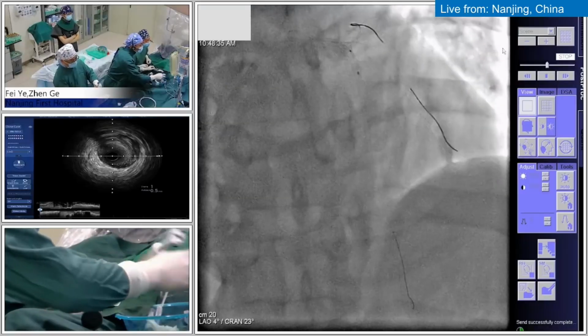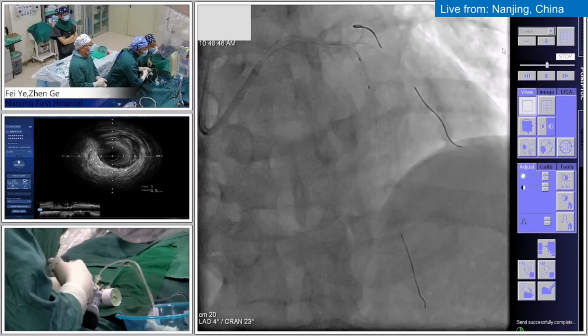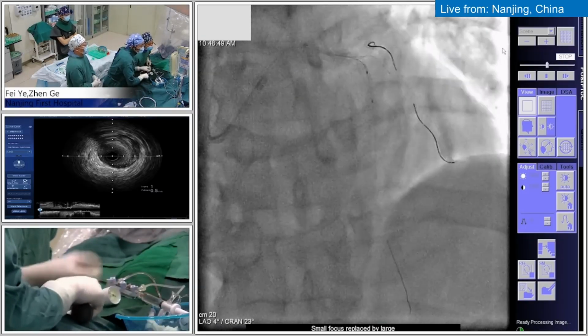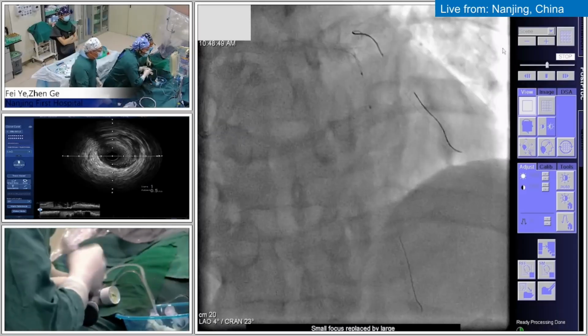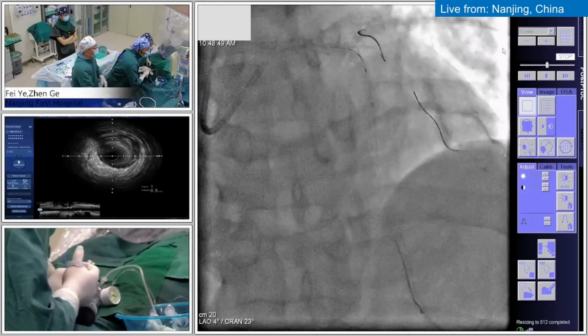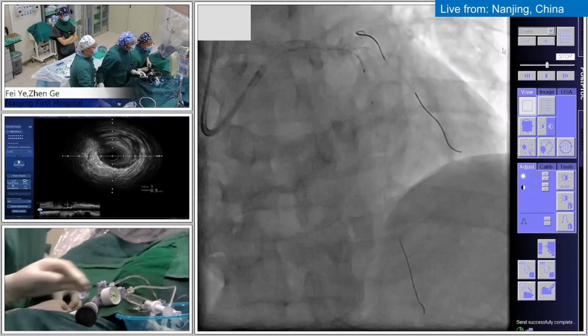Yes, the angulation is very sharp. Everything is here. Almost a little bit here. Test some more. Understand? It's not clear. Here. Okay.